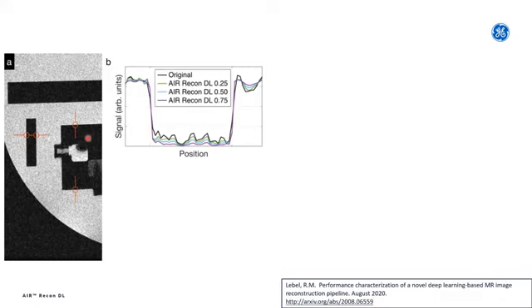And we did this experiment in another, independent way, and we looked at simply the edge information of a phantom. Whereas before I was looking at the ability to resolve structures, now I look at the actual edge of a sharp structure, a phantom, and plot the signal profile along these different edges. I might get some data that looks like this. This vertical drop represents one edge and this represents another edge.